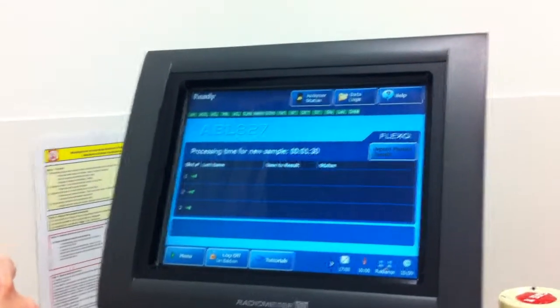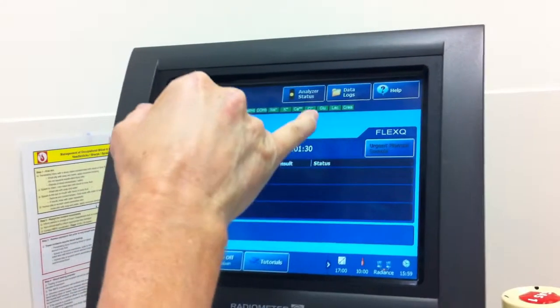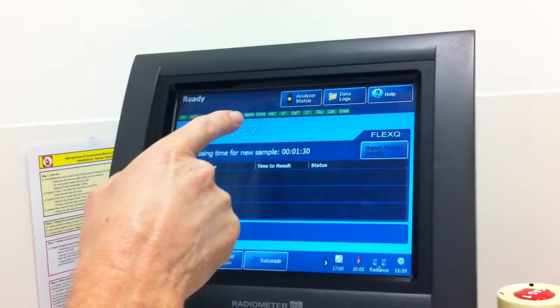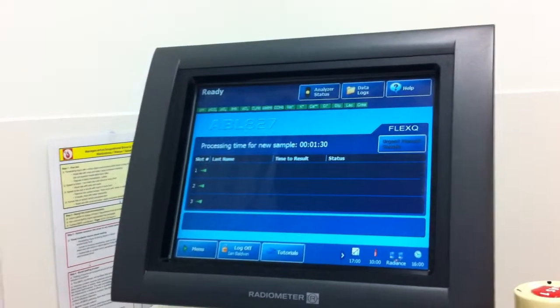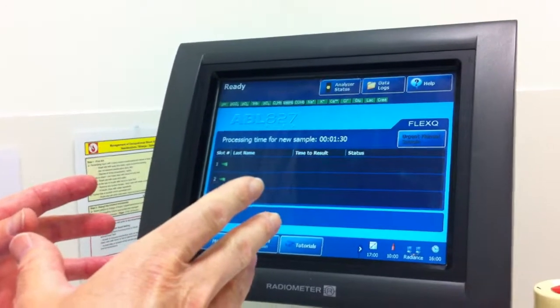So they range from the blood gas, but importantly include electrolytes, glucose, lactate, creatinine — there's a hemoglobin in here. And if they're not working, you'll see one of them has a little cross through it. So you can still process your sample, but you won't get that element in your results.